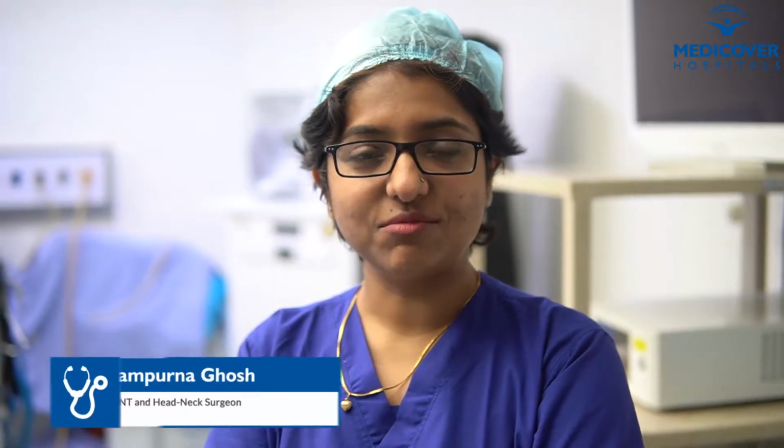Hello everybody, I'm going to show you today how and why we do the DISE procedure, which is called drug-induced sleep endoscopy. So when a patient comes to us with snoring, first we try to understand whether it is simple snoring or a disease called obstructive sleep apnea. There are many ways to differentiate, from clinical symptoms, from sleep study, and also from the DISE.